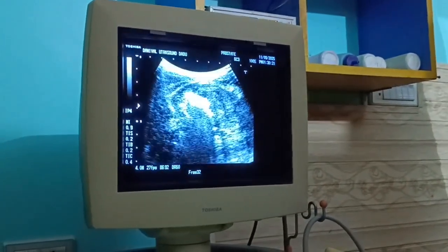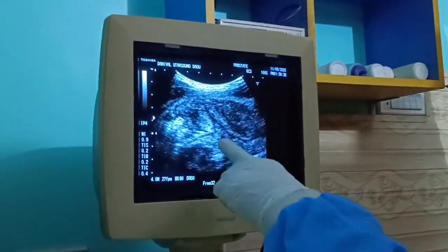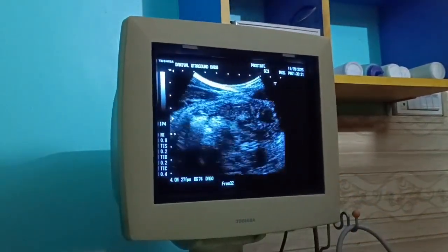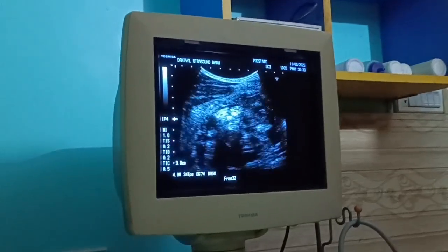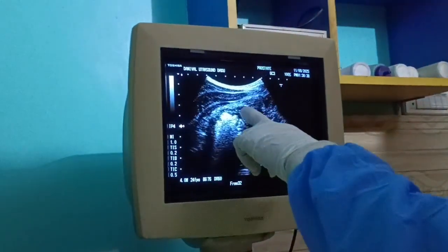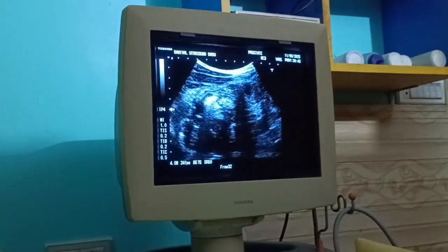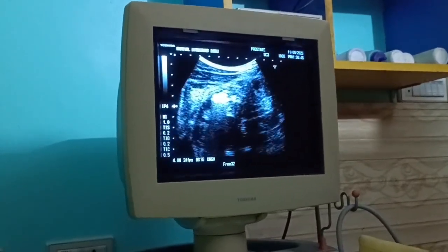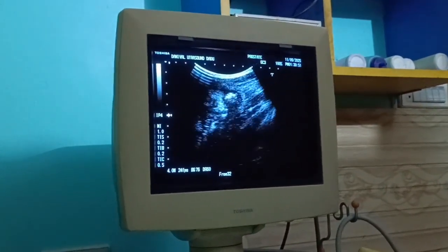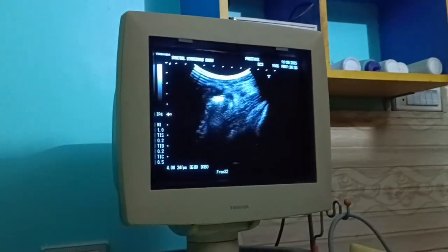Like these are guts which are adherent, contracted, especially in the right ileocecal area, and also there is a gut wall thickening of the cecum ileocecal area with impacted fecal matter. Along with these features, here is also another segment which is showing thick walled guts.